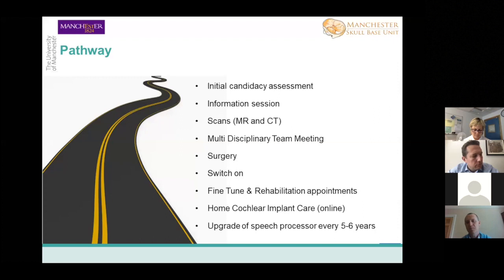And so I don't know, for the last 2 years or so, we've tended to use the 622 as our go-to hearing preservation electrode if we felt that there was significant hearing to preserve that might benefit the patient, i.e. that they might end up using a hearing aid afterwards, not just because we're going to try and preserve a bit of hearing. Okay, brilliant.